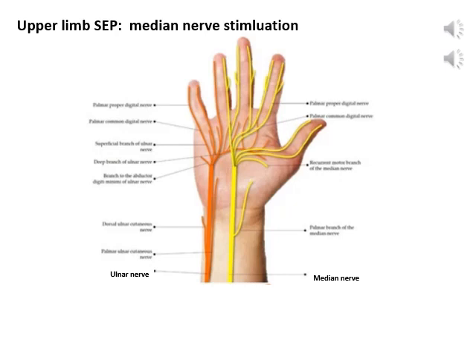Because the median nerve innervates the thumb and some of the intrinsic hand muscles, application of high stimulation may result in movement of the thumb plus some of the fingers. We will talk more about the location of the stimulator and stimulation parameters in the module on stimulation.